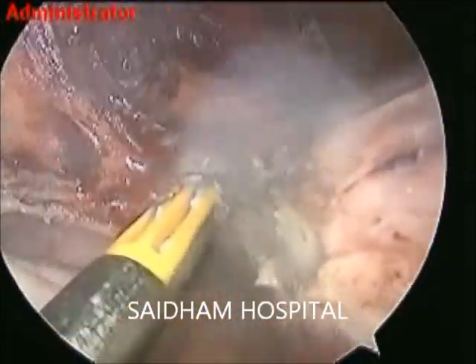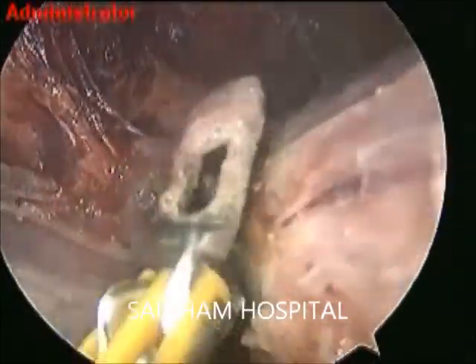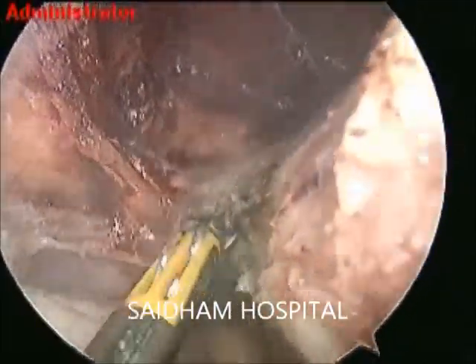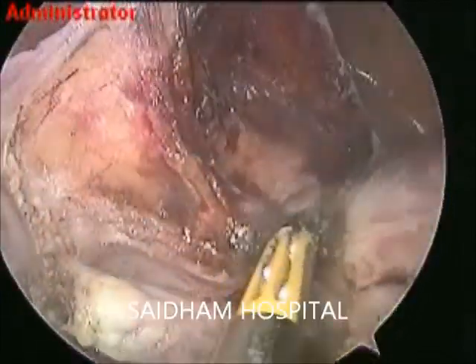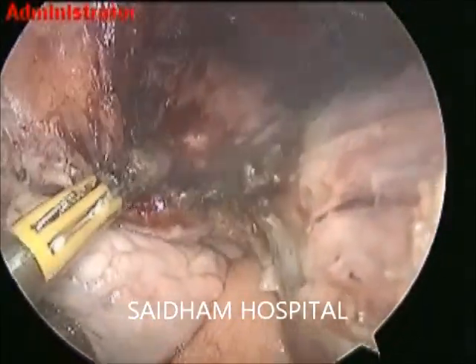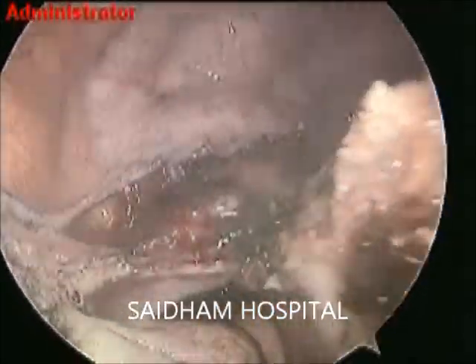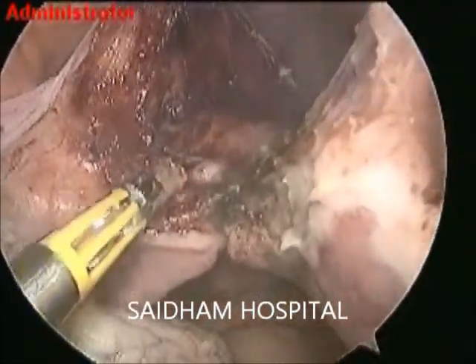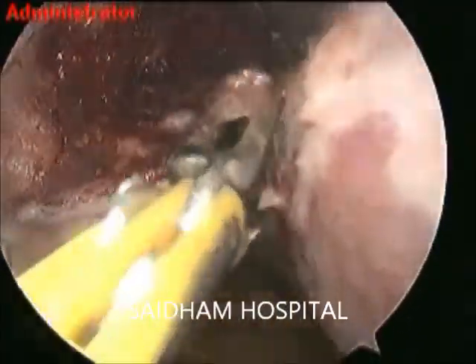Now I am lifting the middle apart and cutting the central part of the UV fold, or the central pillars of the UV fold. Now it is time for venous coagulation — coagulate the uterine vessels. I have taken the simple bipolar for venous coagulation, because with the advanced cutter there are chances of accidental cutting of the uterine artery for beginners.